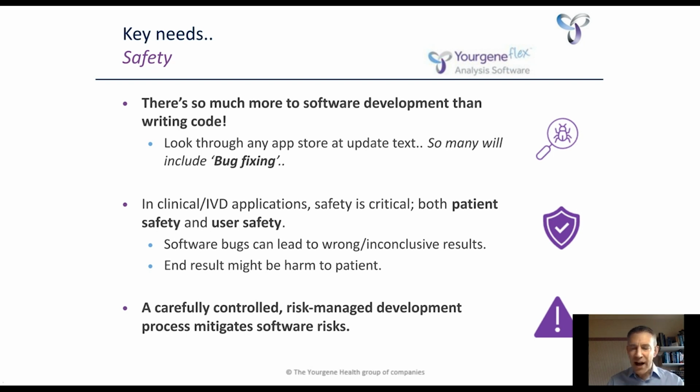There is one other little thing to say on this, which is that if you don't have a controlled process, there's always going to be a risk that there are unseen, latent software errors that could cause problems. And that's actually further exacerbated if you have a lot of SOUP, standing for software of unknown provenance. Essentially what that means is anything that hasn't been developed by the team that's doing the core development itself. So if they're bringing in components or libraries from outside, anything they haven't created themselves.